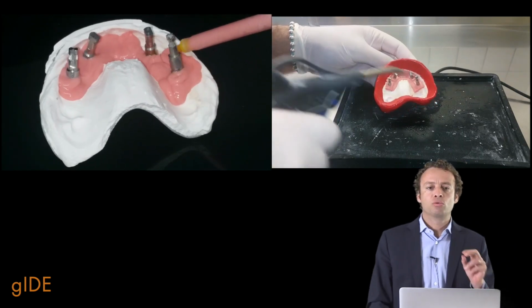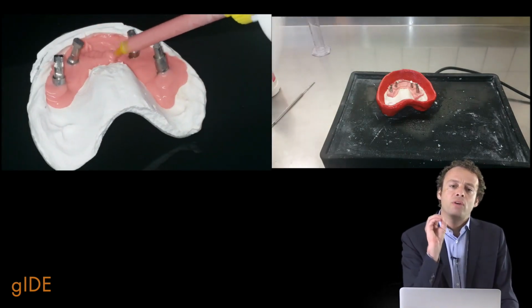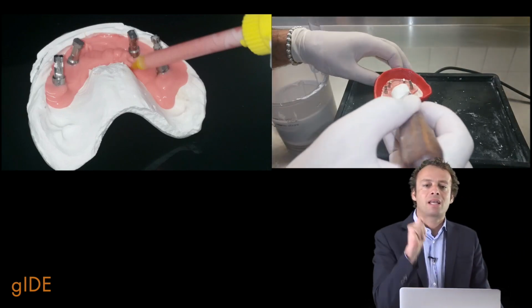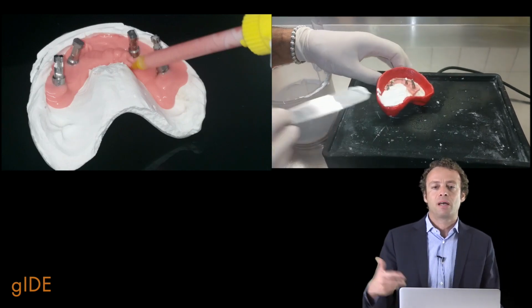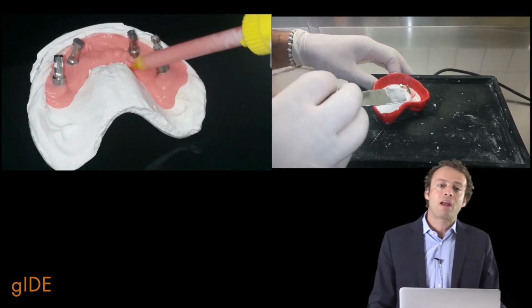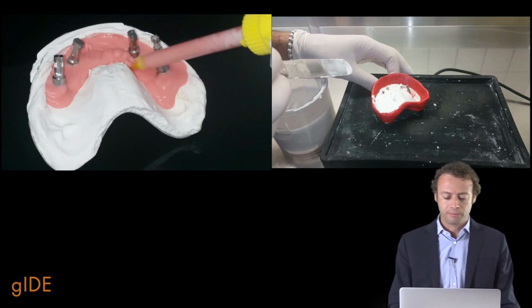And it is really important to create these soft tissues, not because they are important to finalize the work, but just because I want to remove them from the model. If I don't create this kind of soft tissue, it is impossible for me to remove them, and I have to drill the model with some burrs or some drill, and it's more complicated. And I also have the risk of touching the implant replica, and so compromising the reliability and the precision of my rehabilitation.